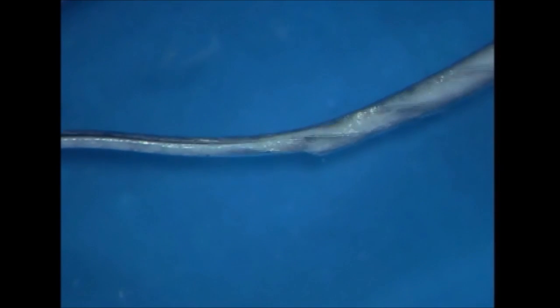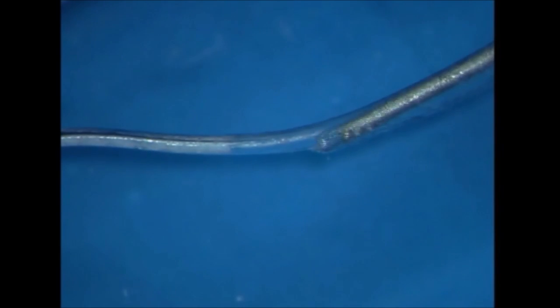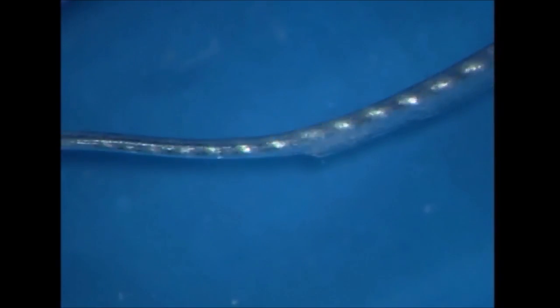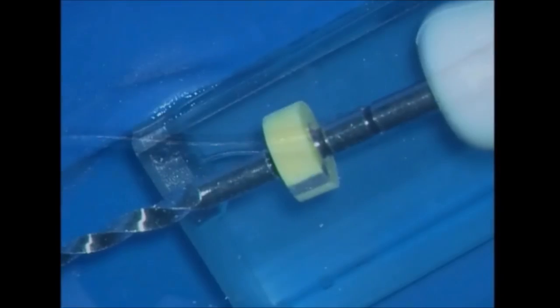Because this instrument has greater tapers as compared to an ISO 02 tapered file, a little bit of rotation on the handle draws the instrument in and begins to buff out the ledge on the outer wall. Irrigate, recapitulate, and re-irrigate to move debris into solution.